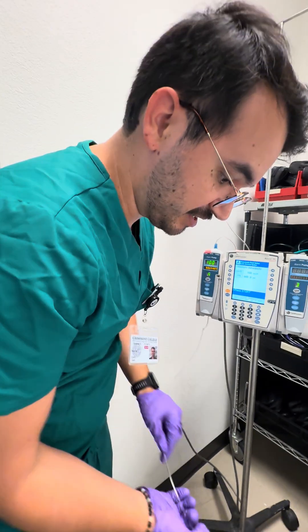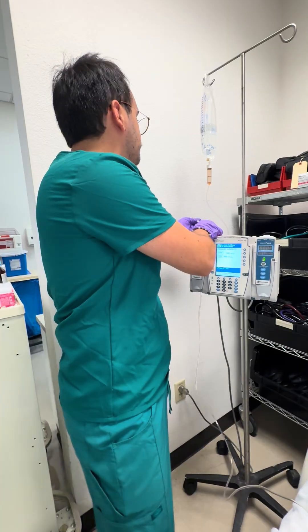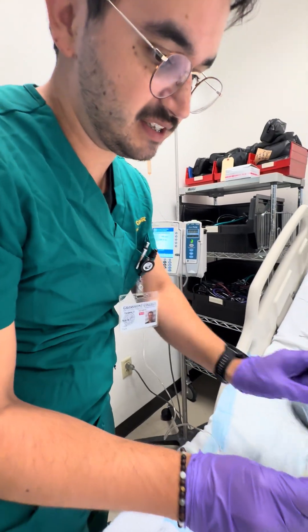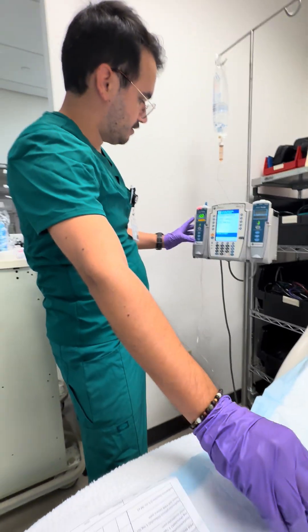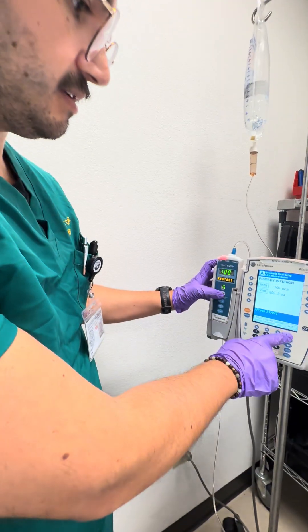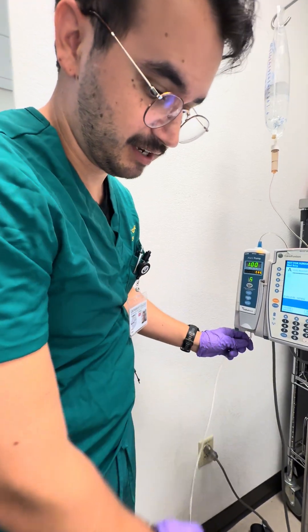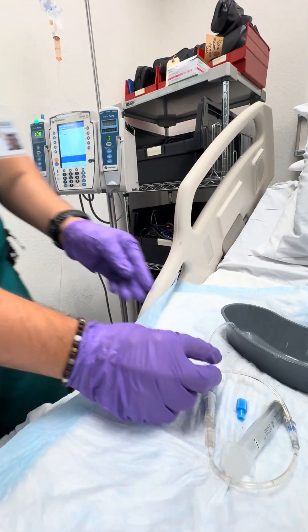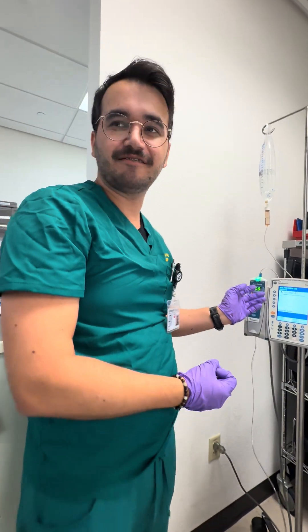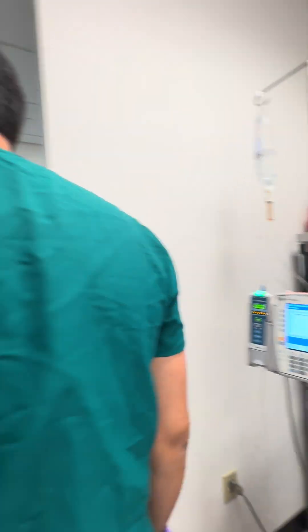Because the tubing has some kinks from prior use, the pump is detecting pressure and alarming. We identify the main kink, straighten the tubing, then press channel select and start to resume the infusion. There is also an occlusion at the connection point which we address. Once resolved, the primary line is infusing and we can prepare the piggyback medication.